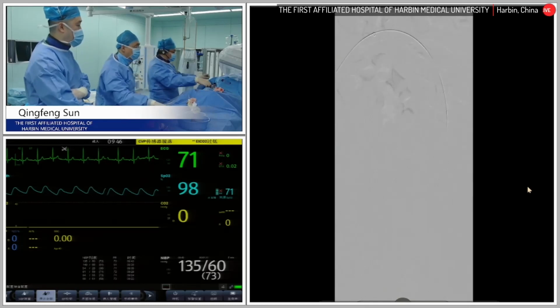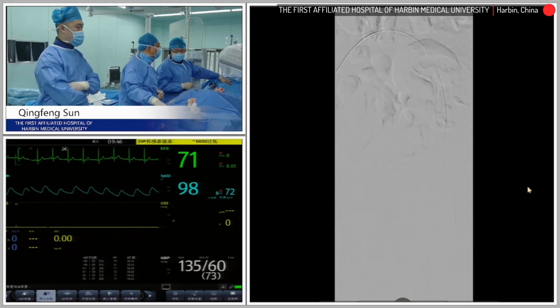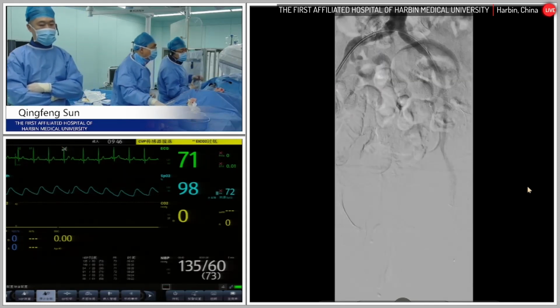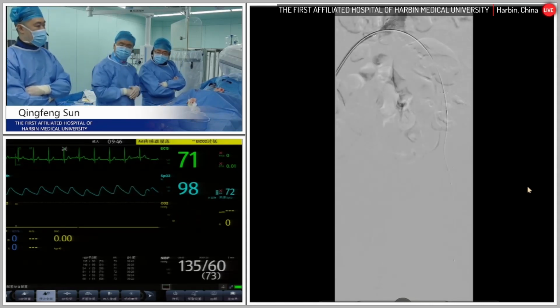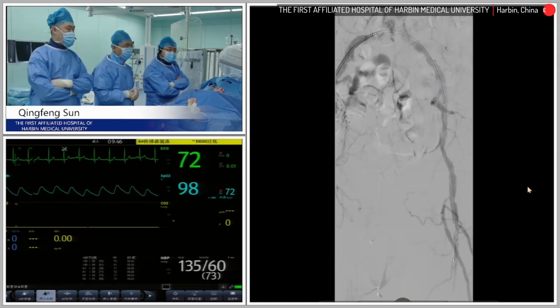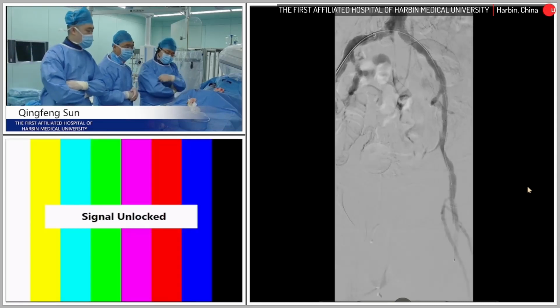Okay. Dr. Sun, I think we are very close to the end of this transmission. Before we finish this procedure, I think the audience wants you to make a summary of this patient and this procedure. Anything the audience can take home? Yeah.